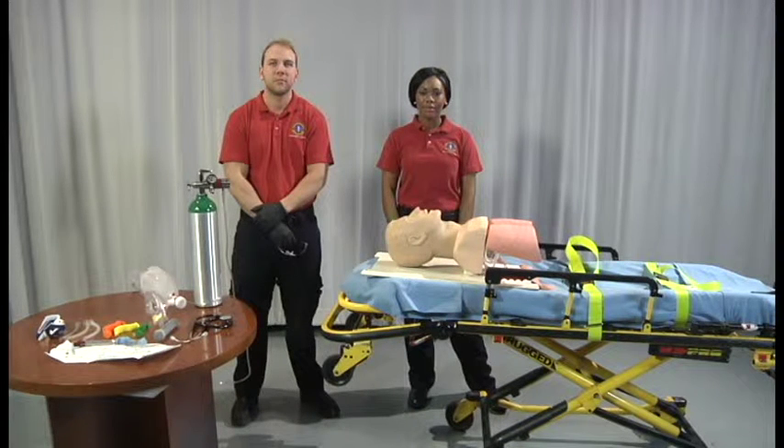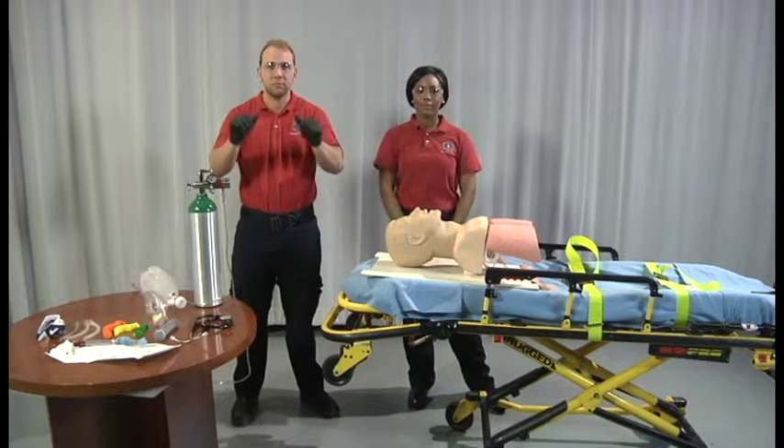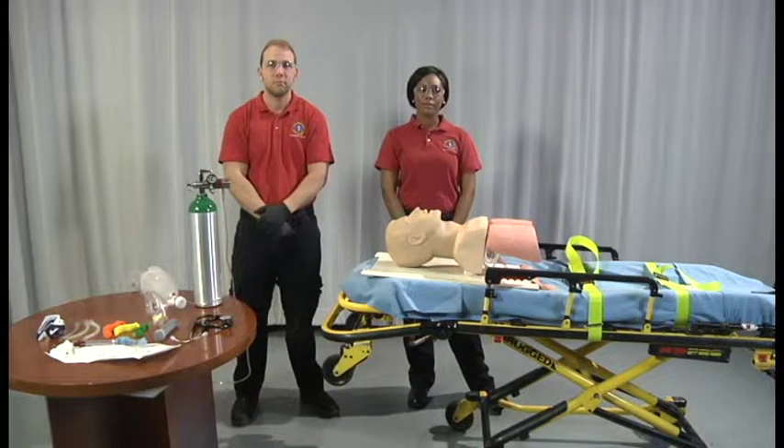Begin by taking appropriate body substance isolation precautions. Ensure your patient is being pre-oxygenated via bag valve mask and simple adjunct.